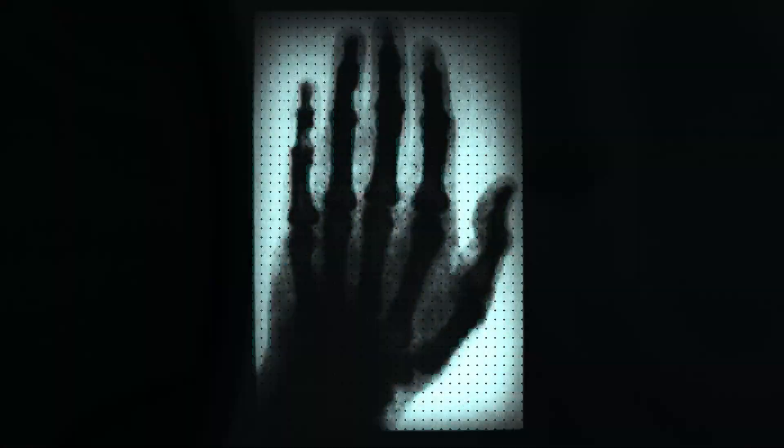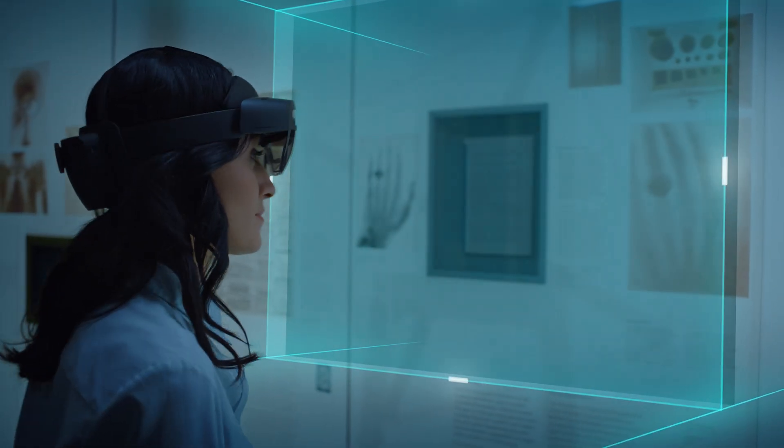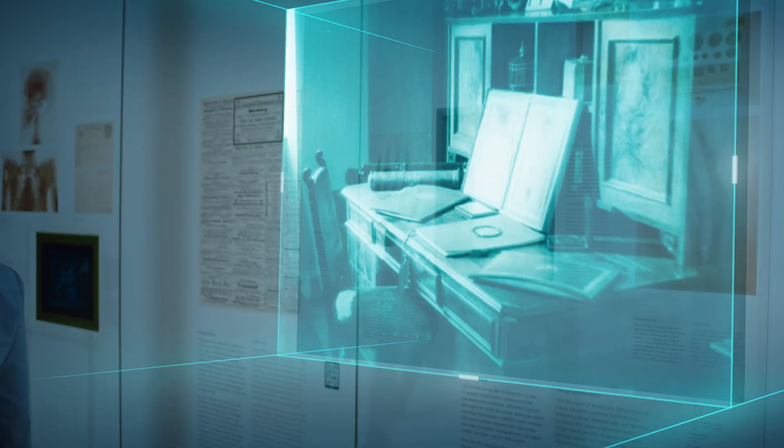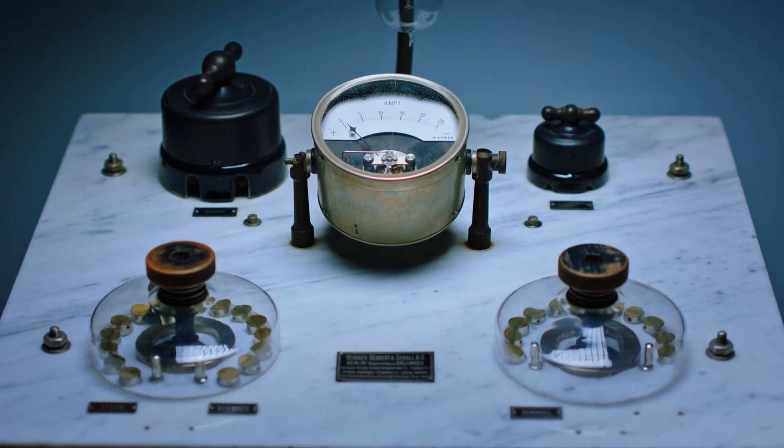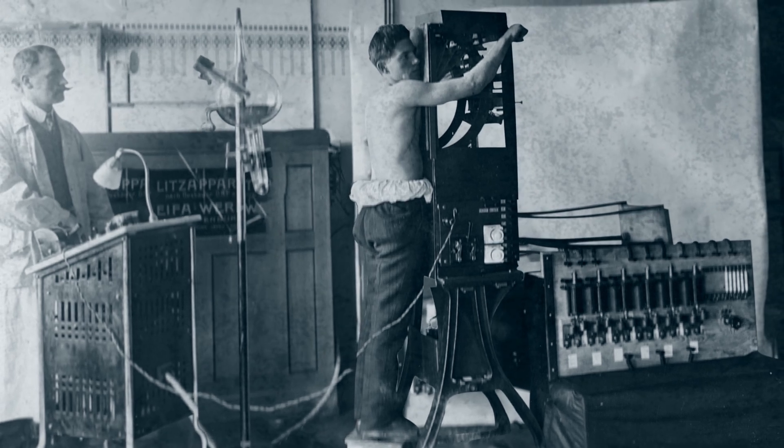It took 15 minutes for Röntgen to capture the world-famous first shot of his wife's hand. By 1909, we could take X-rays with our flash unit in just a few milliseconds, making the contours of the heart visible for the very first time.